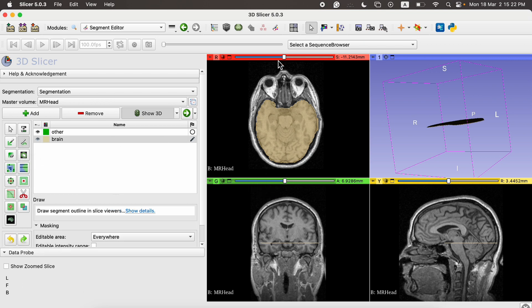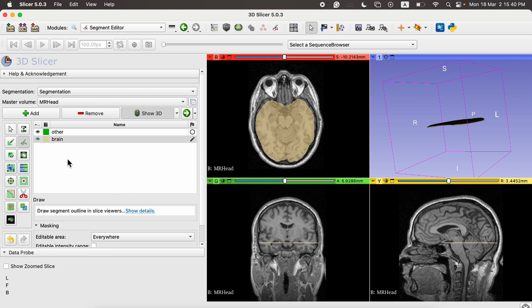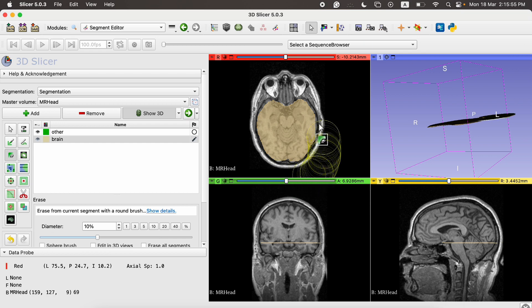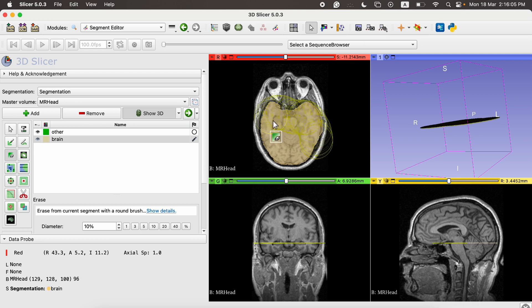The draw tool allows us to draw using a mouse or trackpad. Once satisfied with the shape, press Enter and it will generate the segmentation. We can use these two tools together for manual segmentation, and if we make a mistake we can use the eraser. We can increase the eraser diameter similarly and erase unwanted regions.